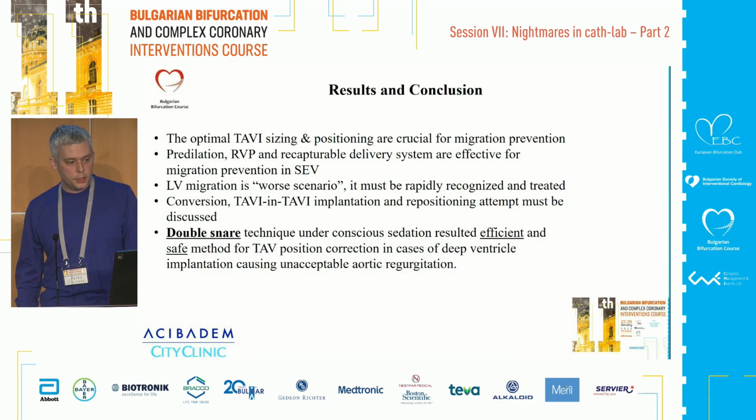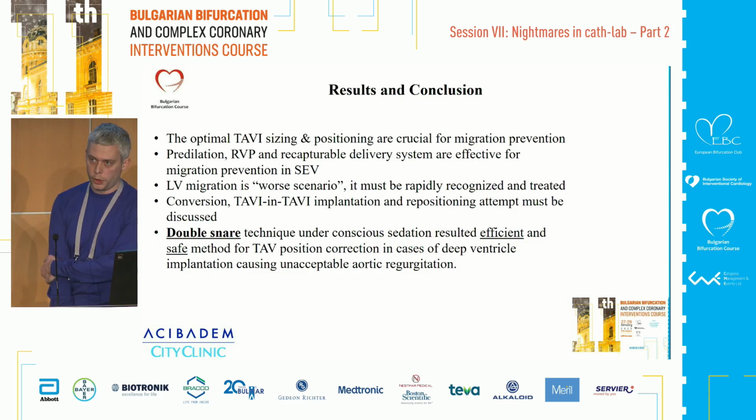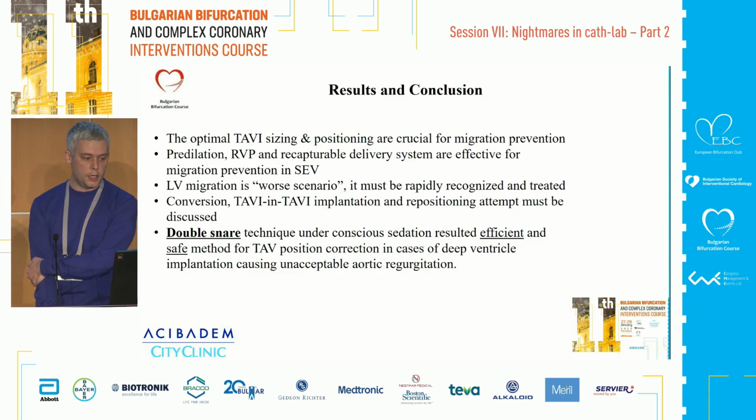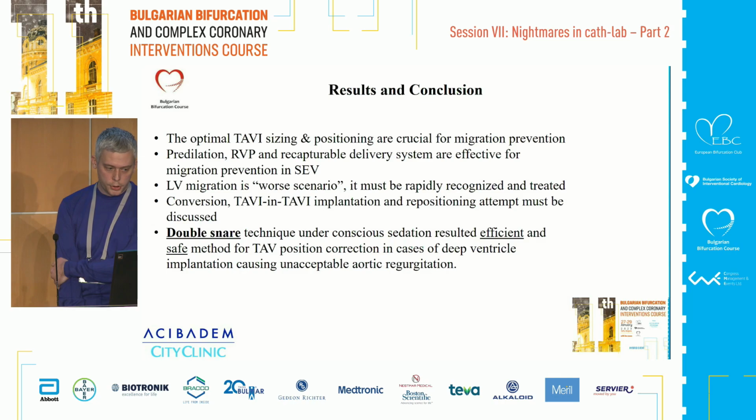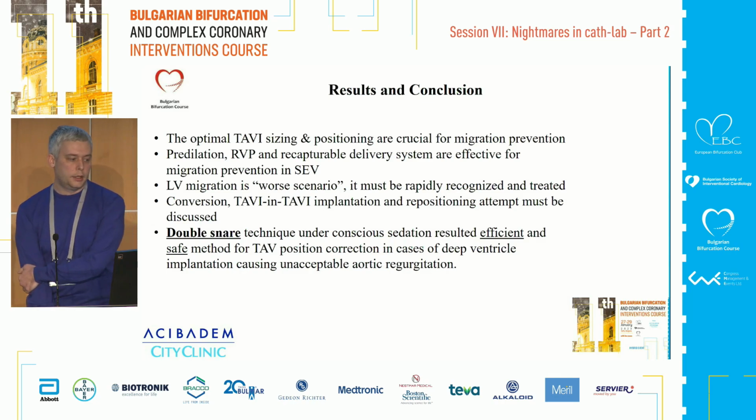So as a result, optimal TAVI sizing and positioning are crucial for a better result and prevention of TAVI migration. Migration into the left ventricle is anyway the worst scenario, and conversion to open surgery, valve in valve, or an attempt to reposition are things that can be discussed.